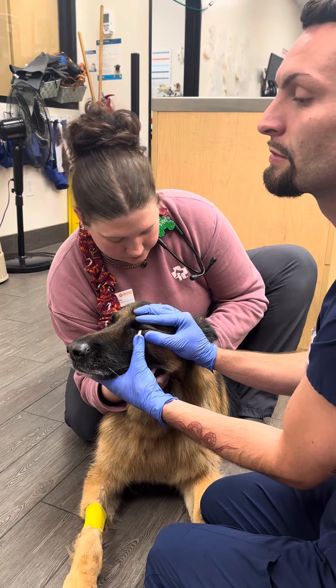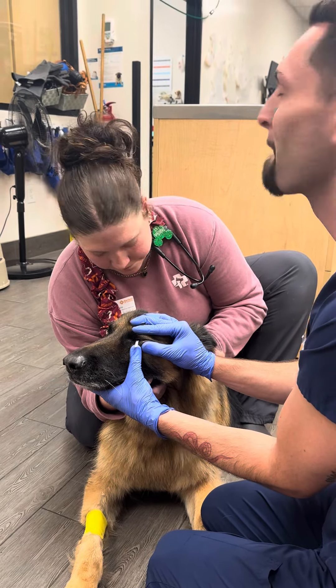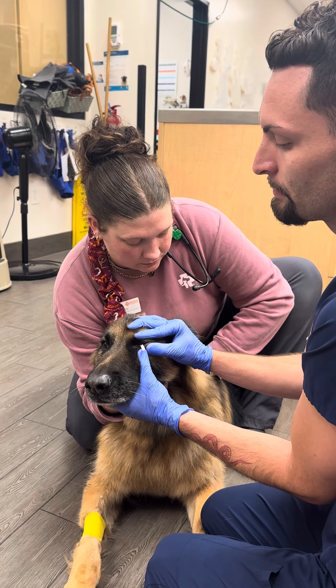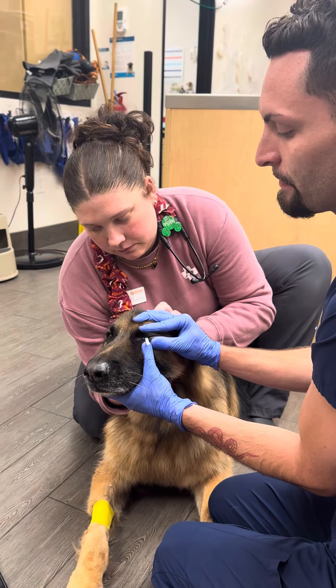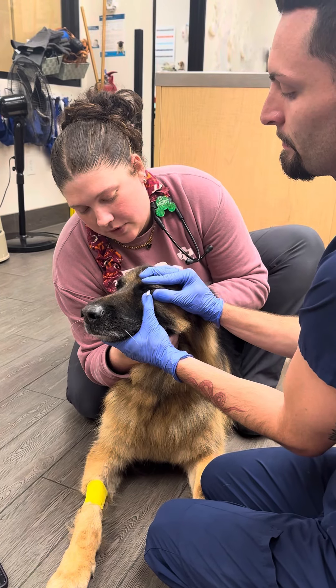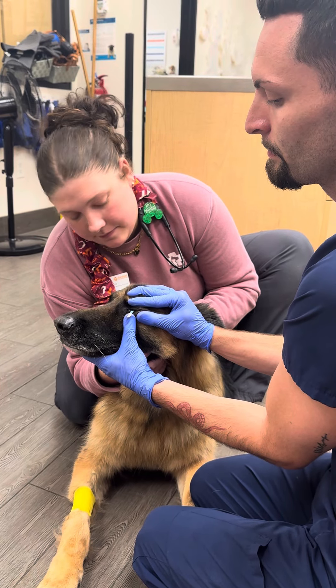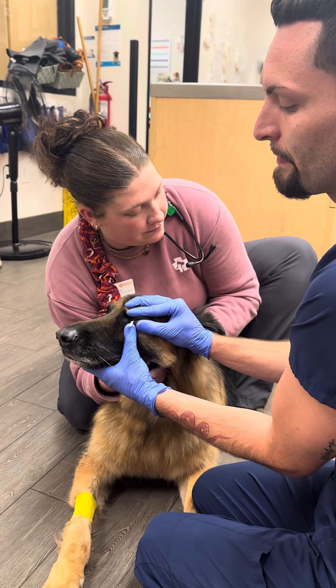And then I will start the timer for one minute. It's okay, buddy. It's okay. Just wait one minute.